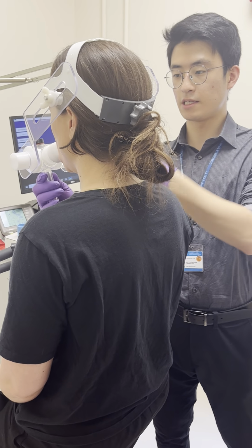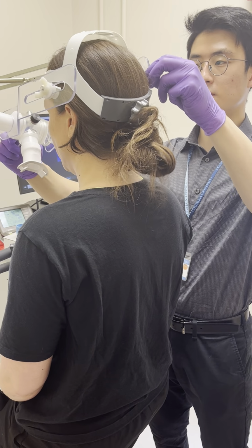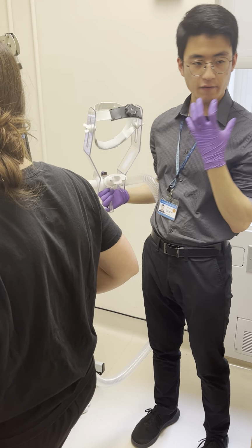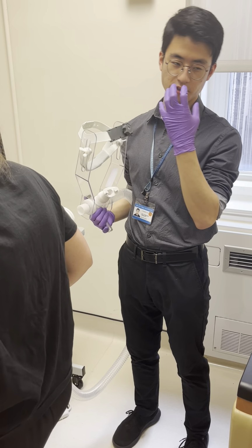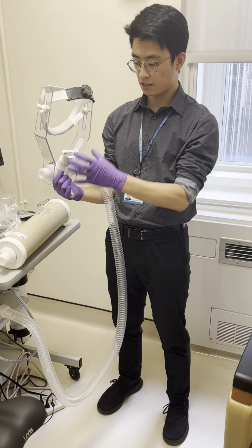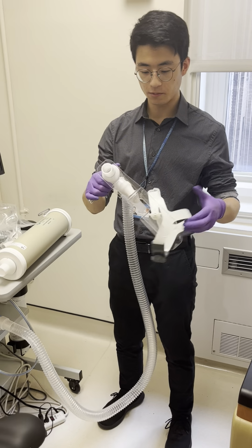So then we're gonna take this out. Tighten a little bit. Take this off for now. Okay. So do that first before proceeding with the rest of it, because if they have this on the whole time and there's some fidgeting going on around here, then it's really uncomfortable. And you probably want to have a clean surface to put this on, because this is going to be in their mouth. So just have somewhere to put it.